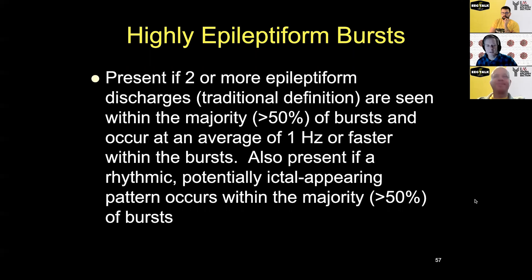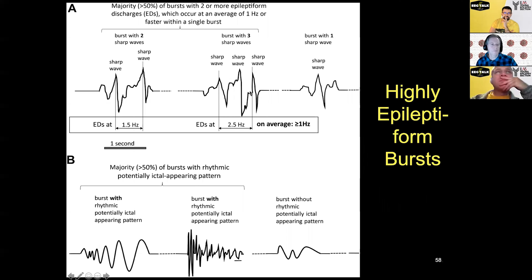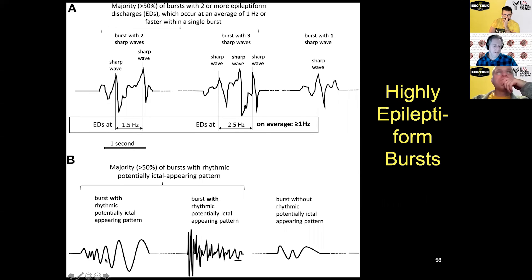It could also be considered highly epileptiform if it looks like a piece of a seizure within the burst — sometimes that periodic discharge looks like a little ictal run within it. Schematically, this shows a patient with barely highly epileptiform activity: two or three sharp waves in each burst, in at least more than half the bursts. If a burst only has one sharp wave throughout, it would not be highly epileptiform. These evolving bursts are another example.